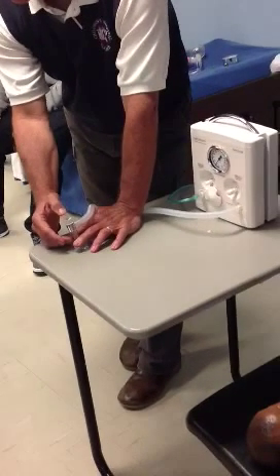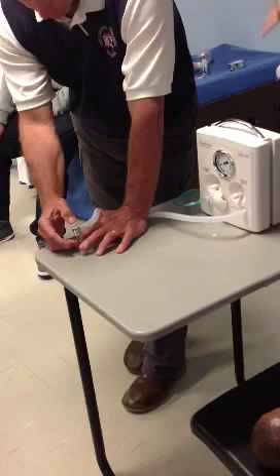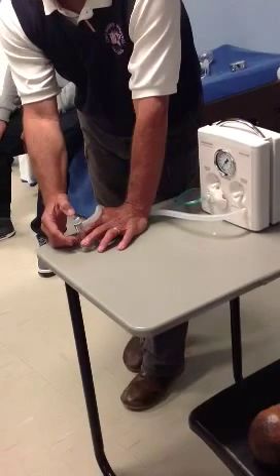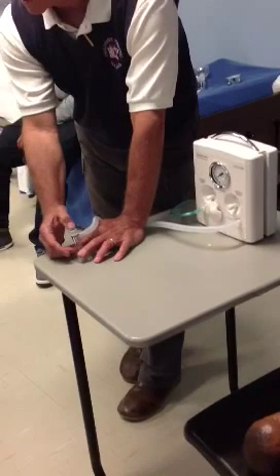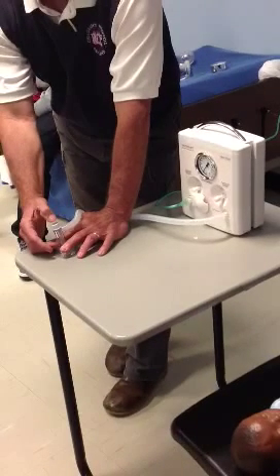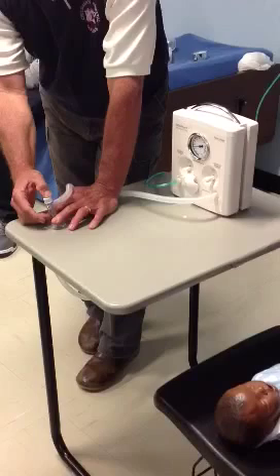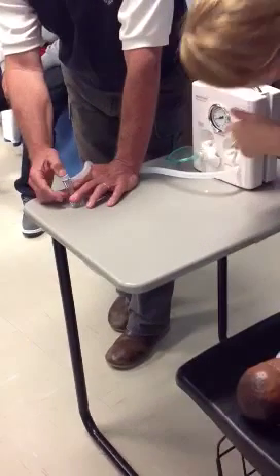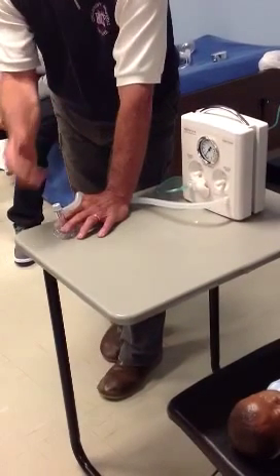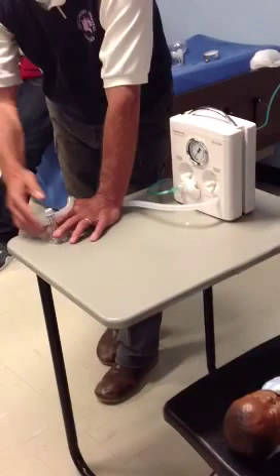I'm going along and my chest isn't moving. Could be the seal, could be head position, could be a mucous plug, or — the simplest explanation — I'm not giving enough pressure, not enough tidal volume. So I increase the pressure; I want to go to 25. Now I'm 25 over 5 — that's the pop-off. That's the whole beauty of it. You can put it on your isolette, on your gurney, and that's what we do: we put it on the gurney and take it with you.